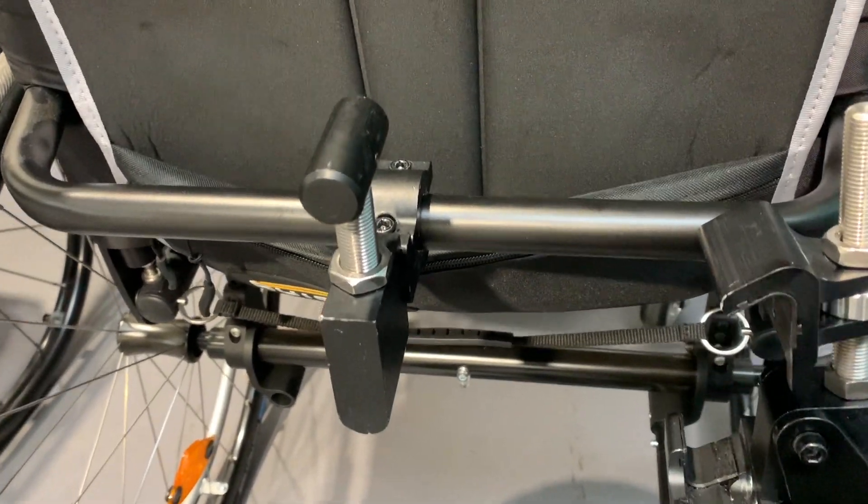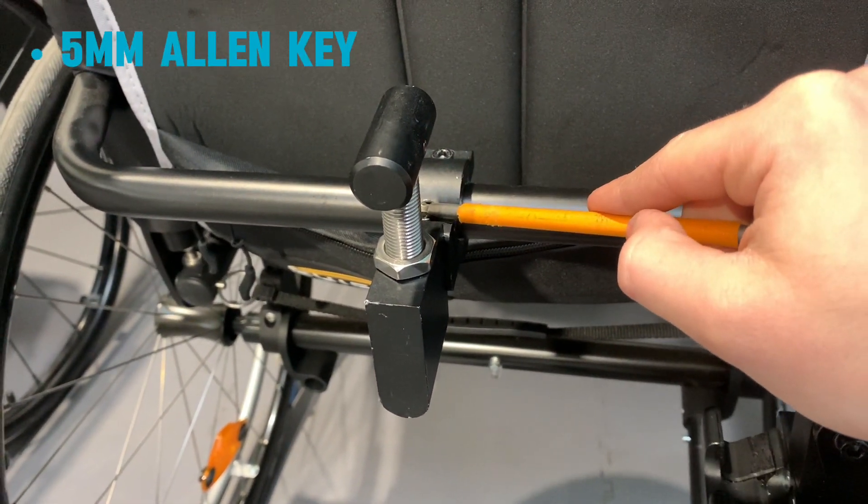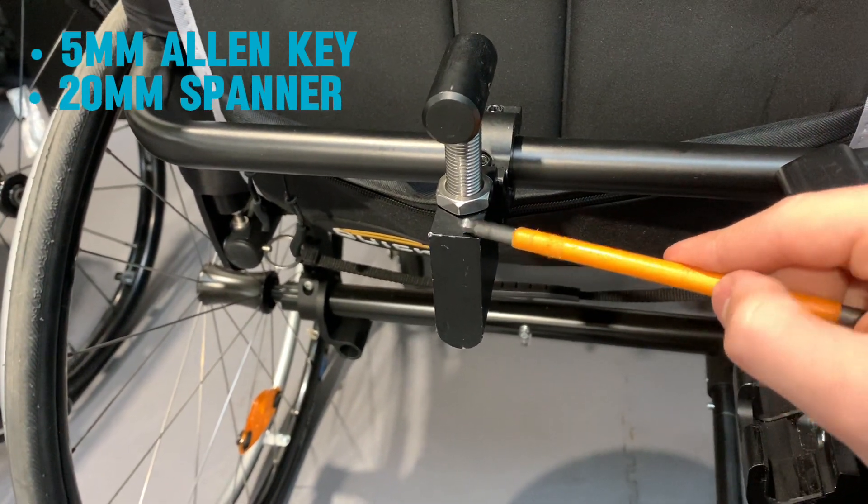So the two tools you will need are a 5mm Allen key for these two bolts here and a 20mm spanner for the nut. You can also use an adjustable spanner.